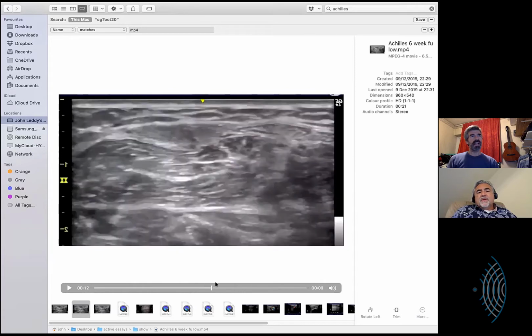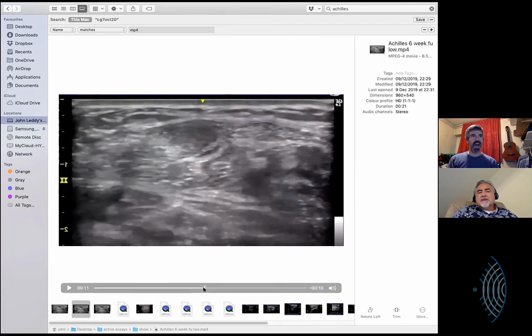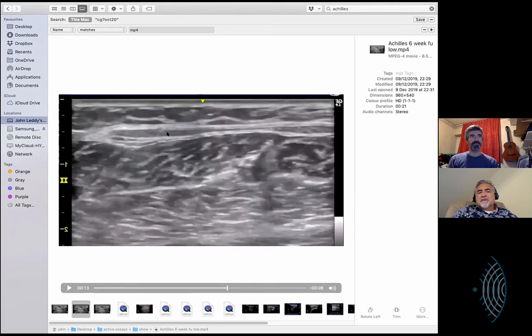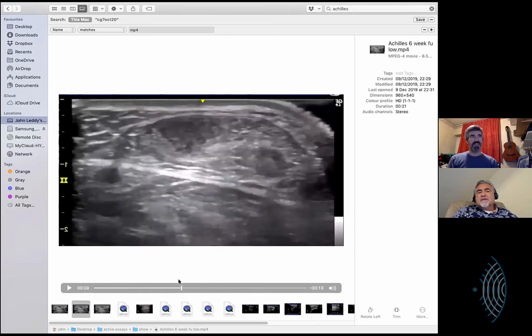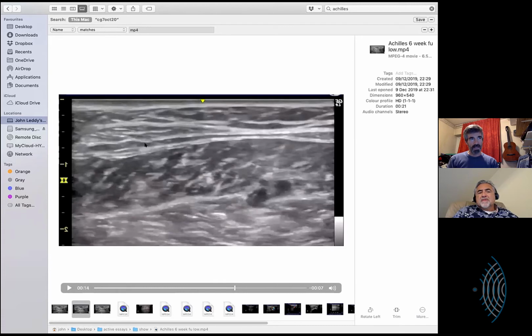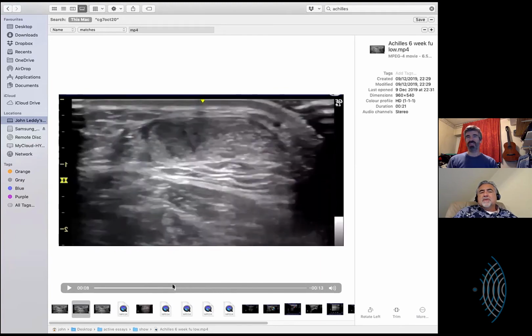Anyway, this is a classic case of, do you see this pathological tissue here? Yes. Yeah, you can get a sense of, it's not entirely reliable, but you can get a sense that it's coming from those gastroc fibers here. You see how you go back to where you see the pathology. Yes. And then you go whoosh, and then you can ascribe it, and I don't really know what the value is, but those fibers, when you follow them back up, are coming from this part of the gastrocs. And so I would ascribe this as likely to be relating to the Achilles fibers of the gastrocs and of the medial gastrocs.